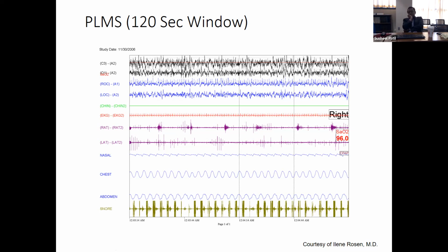You've got a total of 7 leg movements, and they're all part of a periodic train because there are at least 4 of them here, so they would all get counted within that train. Maybe also embedded within Dr. Andressi's question: you can have individual leg movements that can be reported on the sleep study report, but we mostly pay attention when they're part of a periodic leg train, or when there are excessive numbers of leg movements.